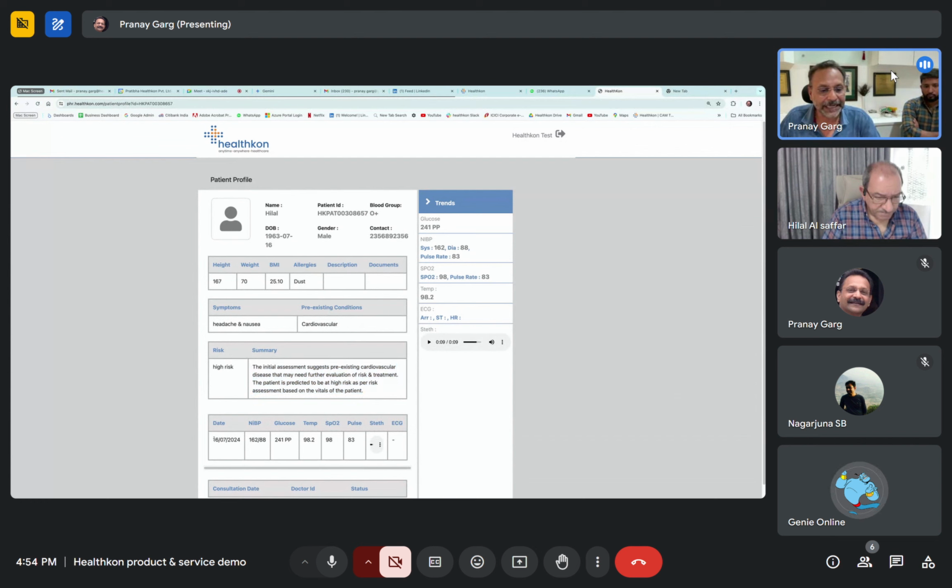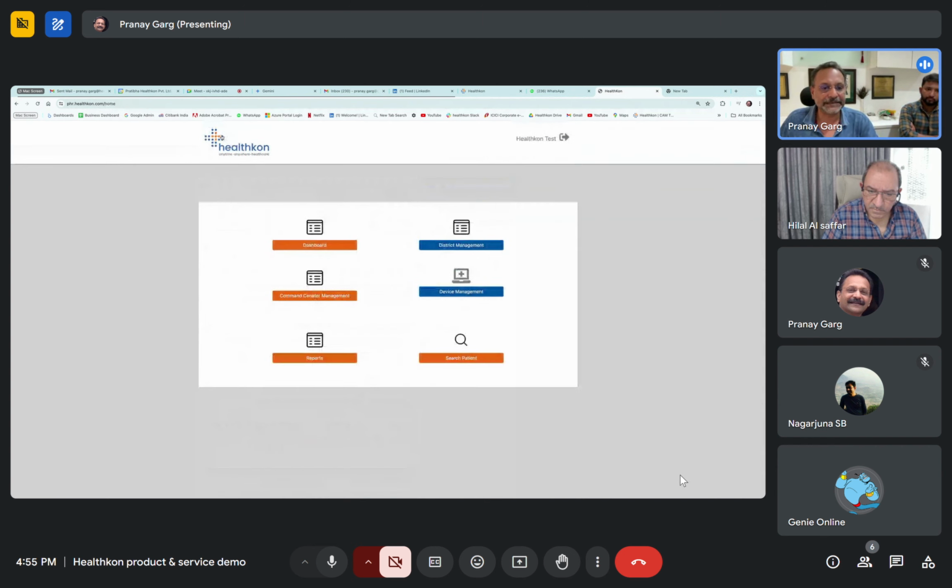You will also see that the date is mentioned here, and in the date, you have also got all of the readings. Here you got the 241 postprandial, 98.2, 98, 83, all of that, and the observation reading as well. So if you want to, you can hear it from your phone, you can hear it from the record also. So this is as far as the first thing is concerned.